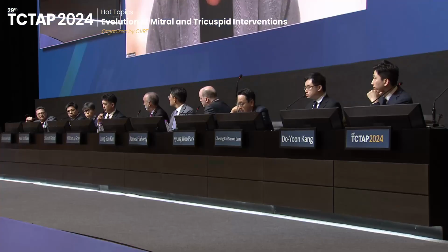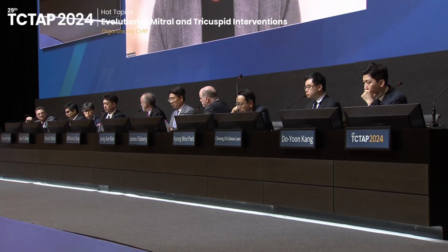Please. Thank you, Kodali-san. My name is Shirai from Japan. Now in the hospital, we are also participating in the TRISCEND Japan trial. But among the candidate patients, only 50% would usually pass, because of too large an annulus and not enough device sizes, and the distance is too small.